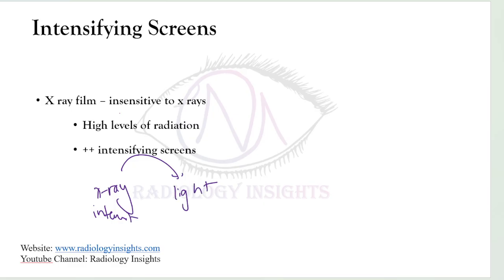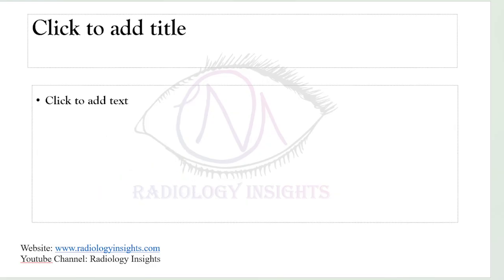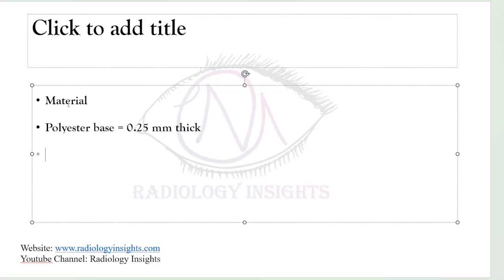So, these intensifying screens are just a sheet of material which is the same size as that of the film. The intensifying screen has a polyester base which is around 0.25 millimeters thick, on which is coated a dense layer of fine phosphor crystals.